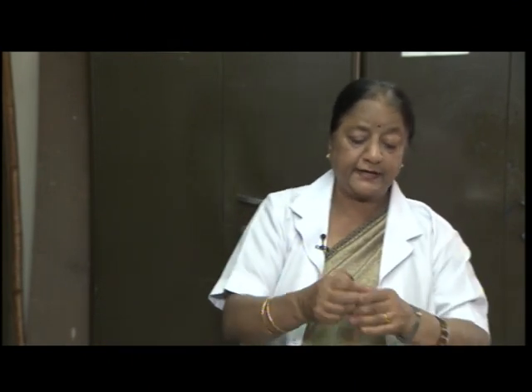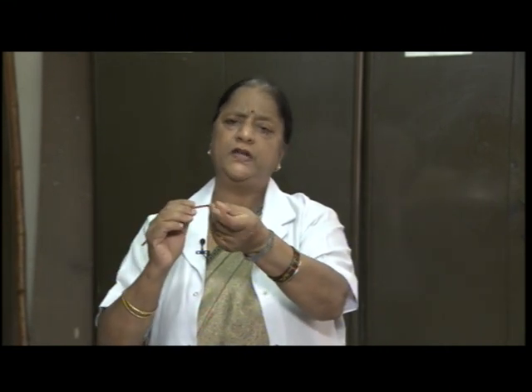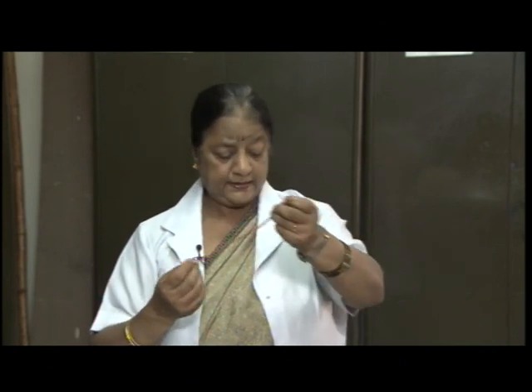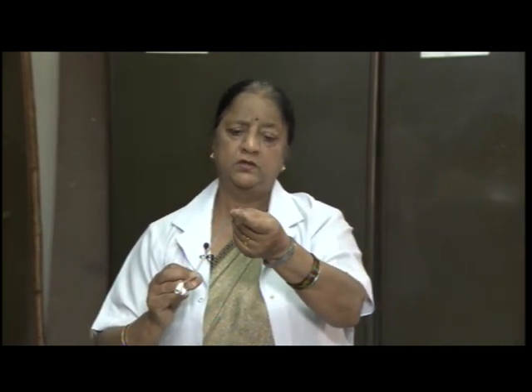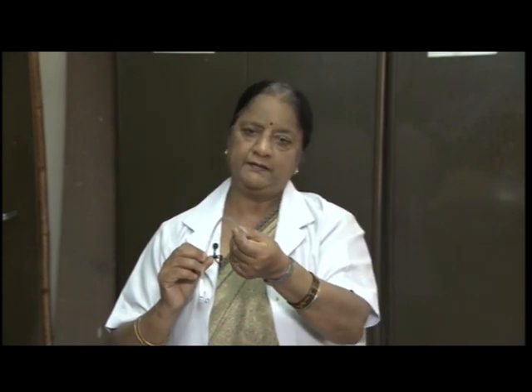And this is ordinary oxygen catheter. When we have to give a patient only oxygen, it is attached to the oxygen source, that is oxygen cylinder. Sometimes we need to do the suctioning of a patient who has plenty of secretions in the respiratory tract. So, we make use of this catheter and attach it to the suction machine and then do the suctioning of the airway to get rid of the secretions and for easy breathing.